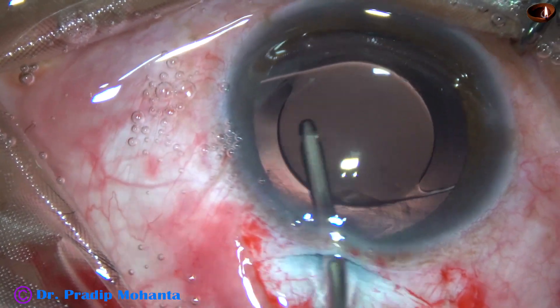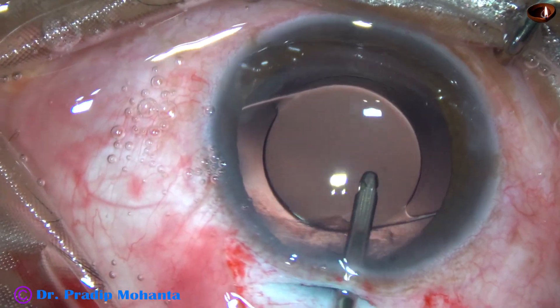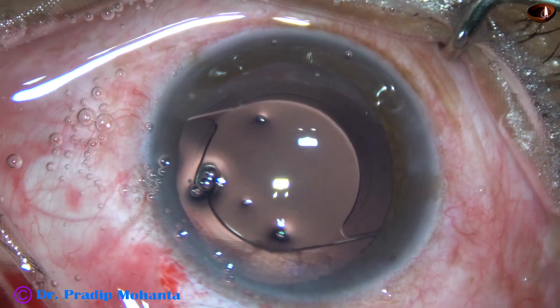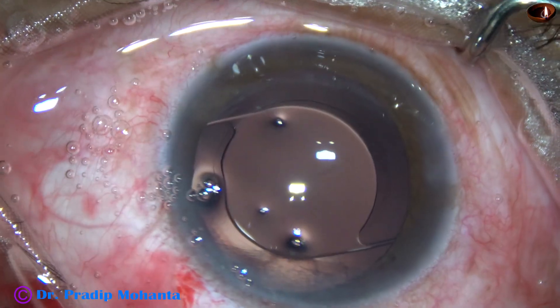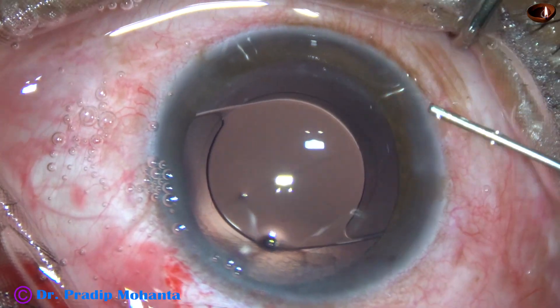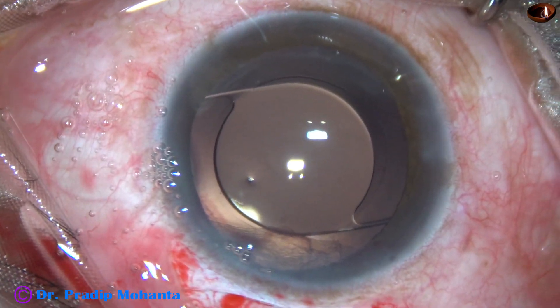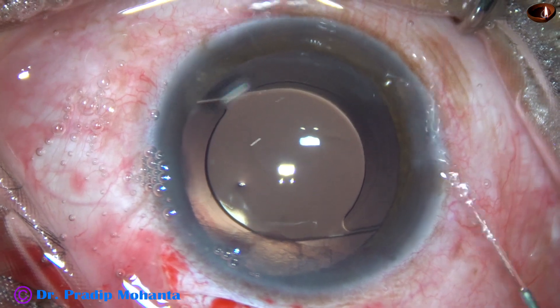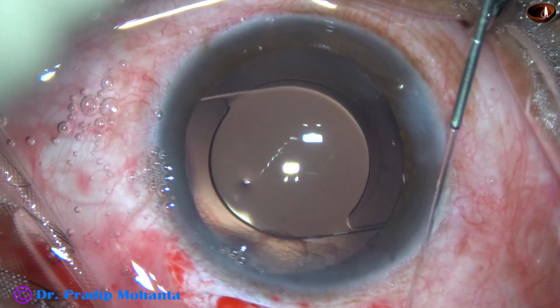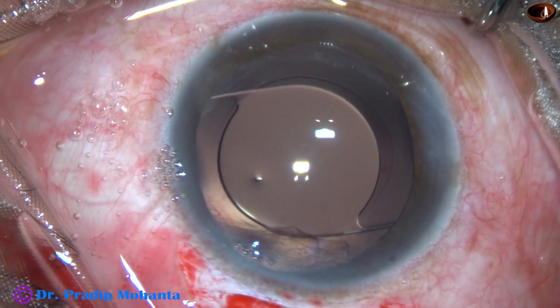The posterior capsule is very clean now. The side port is to be closed. A bit of moxifloxacin is applied. The corneal stroma on either side of the side port is hydrated and the side port gets closed nicely.